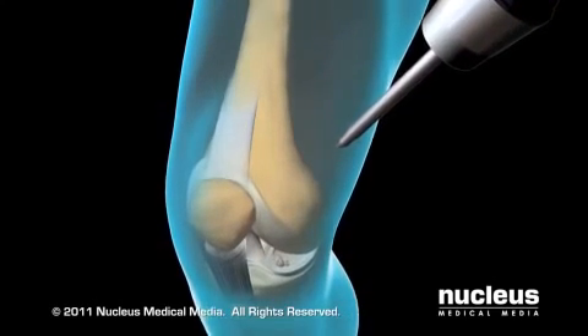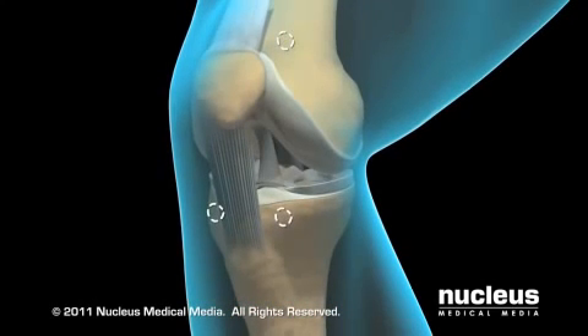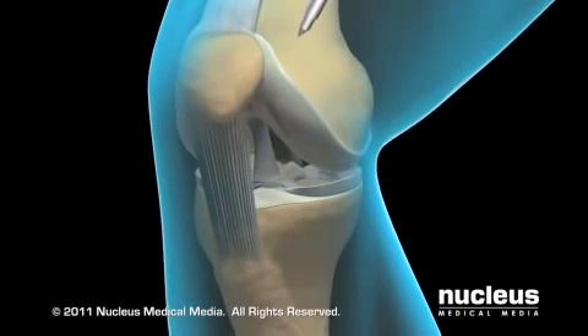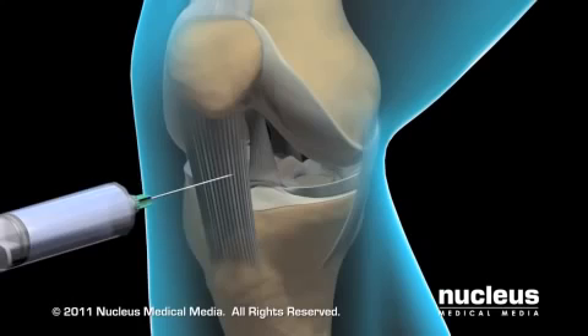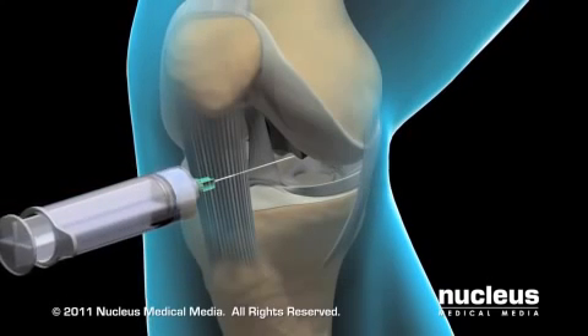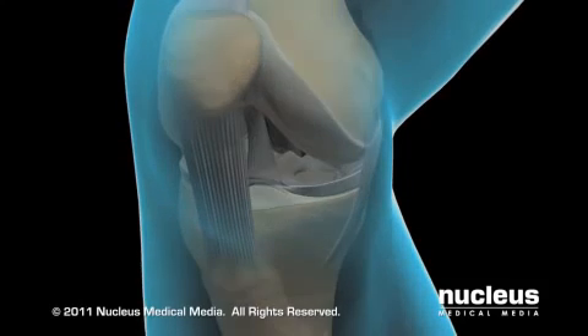An arthroscopic meniscectomy usually takes between 45 and 90 minutes. Your surgeon will gain access to your knee joint by using sharp instruments called trocars to make two or three small openings or ports. He or she will inject a sterile solution into the joint to push the surfaces apart, allowing the structures inside the joint to be viewed more easily.